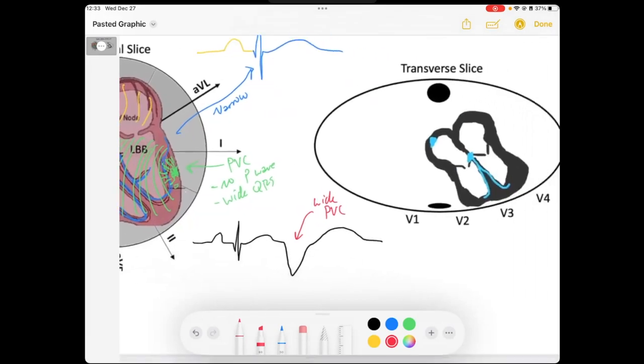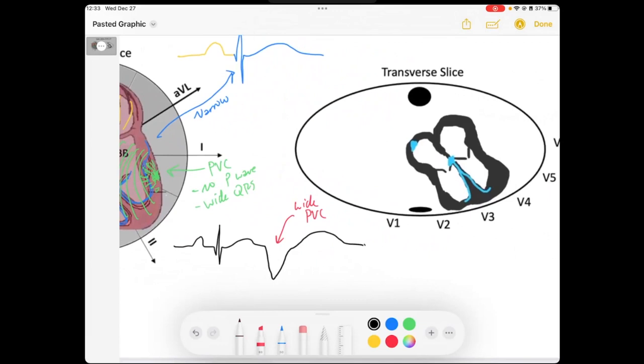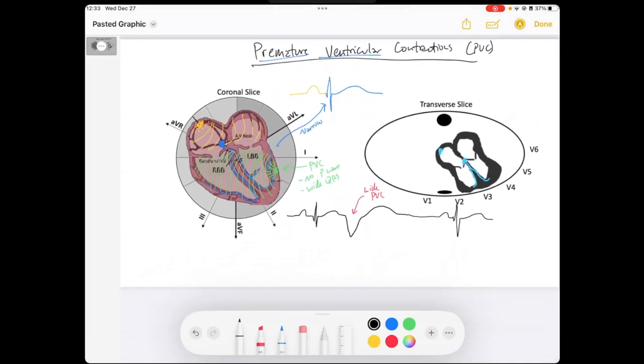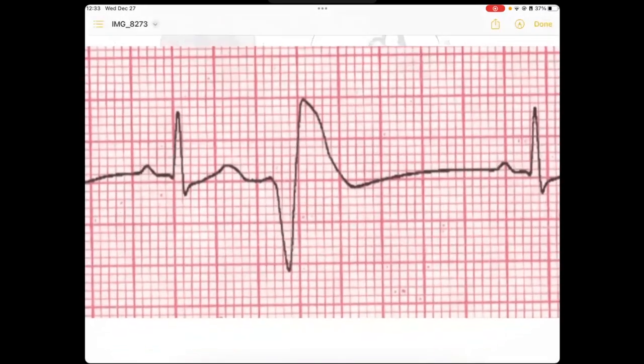That occurs early. And then you might see the sinus node take back over and you have your normal beats. And so let's find an EKG rhythm strip that would demonstrate that.